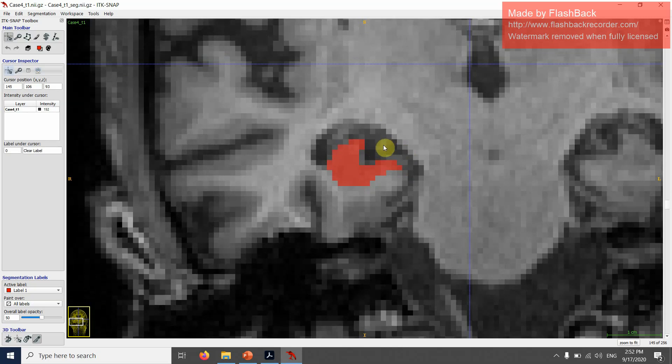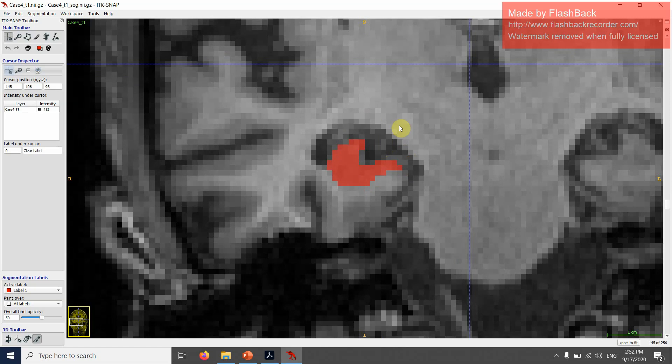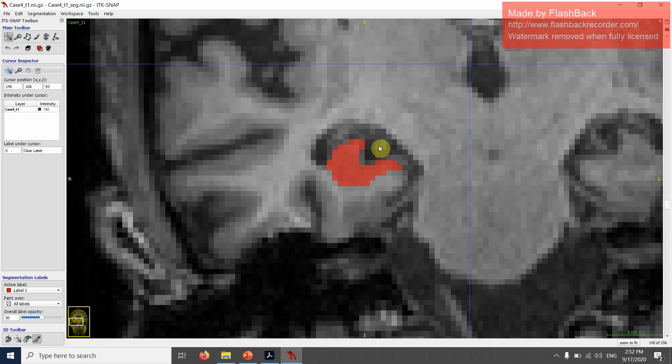I do want to point out that there's a few little voxels here, and I think that's another important point. It can sometimes be a little bit ambiguous to pinpoint the last slice of the uncus. I personally think these are just three voxels. They're not quite the same intensity as the rest of the hippocampus. I think this is probably too little to be considered uncus. However, you could maybe argue that this is still uncus.